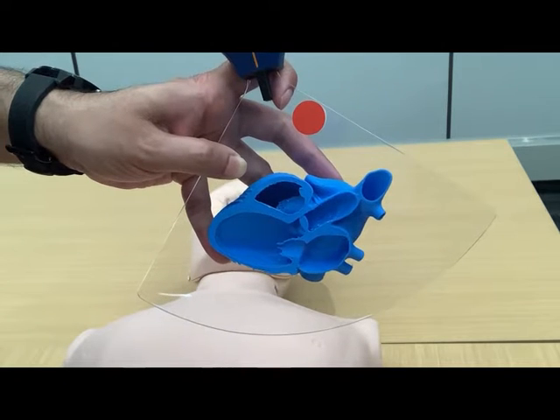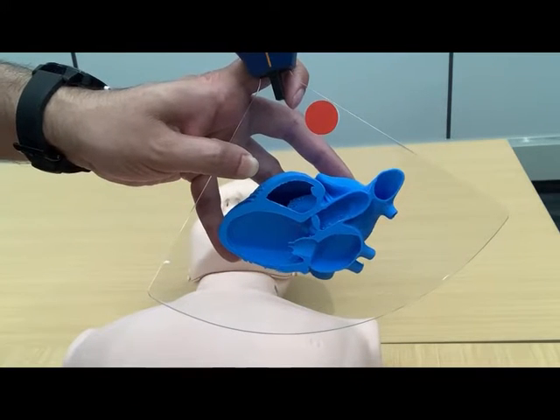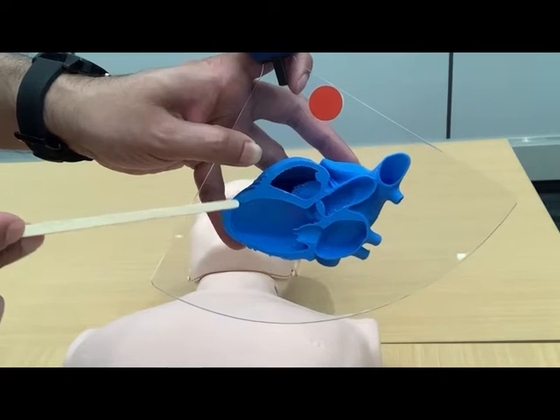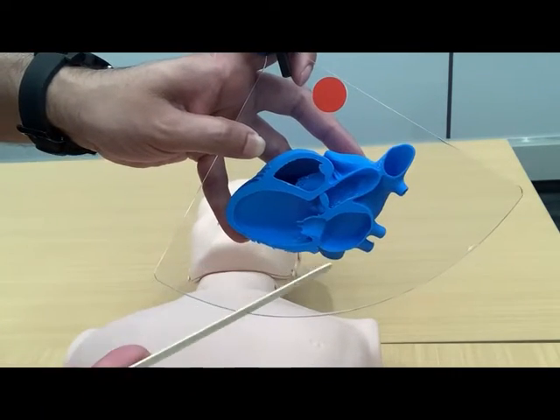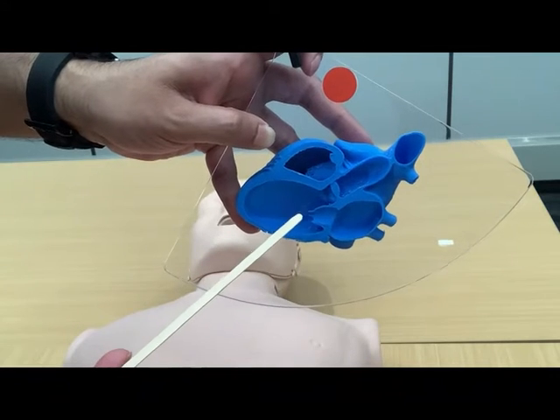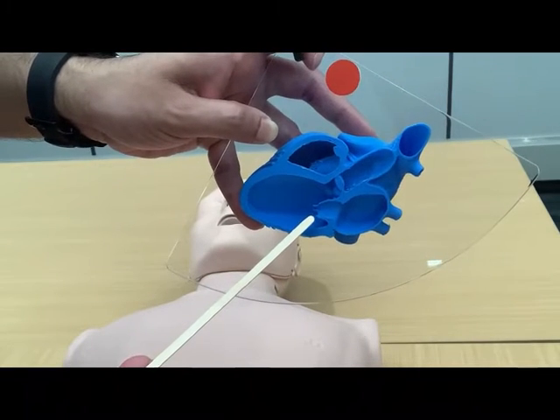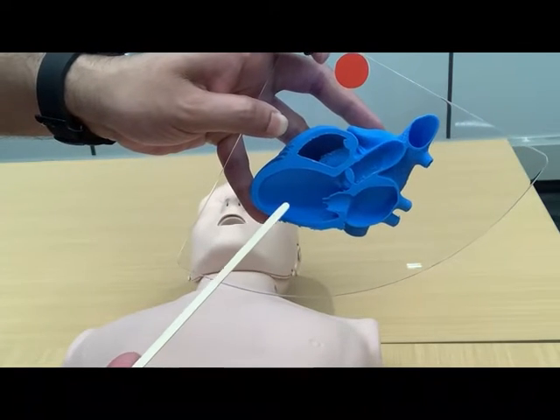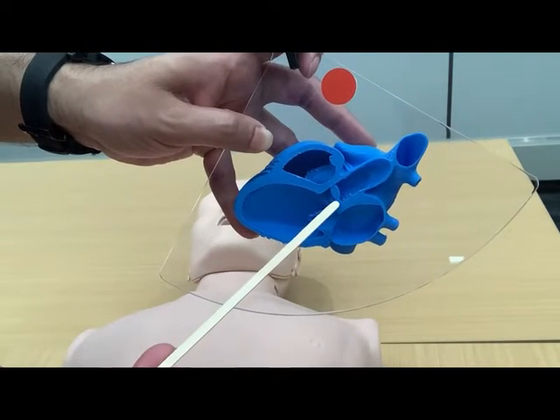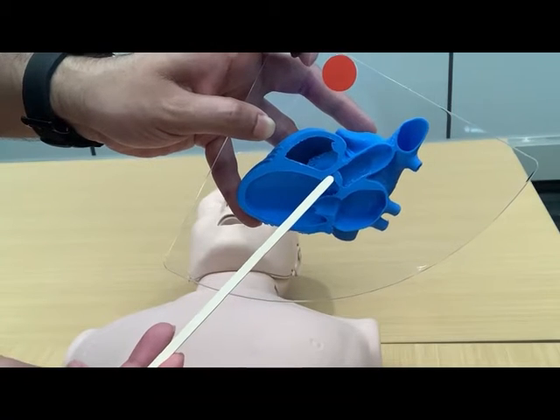Let's identify the different structures seen on the parasternal long axis view. The anteriormost structure — which the beam encounters first going from anterior to posterior — is the right ventricular outflow tract. This big chamber posterior to the right ventricular outflow tract is the left ventricle. The chamber that is more posterior and opens into the left ventricle is the left atrium, and the valve between the left atrium and left ventricle is the mitral valve, with anterior and posterior leaflets. Blood goes from the left atrium to the left ventricle and through the left ventricular outflow tract into the aorta, and the valve there is the aortic valve.